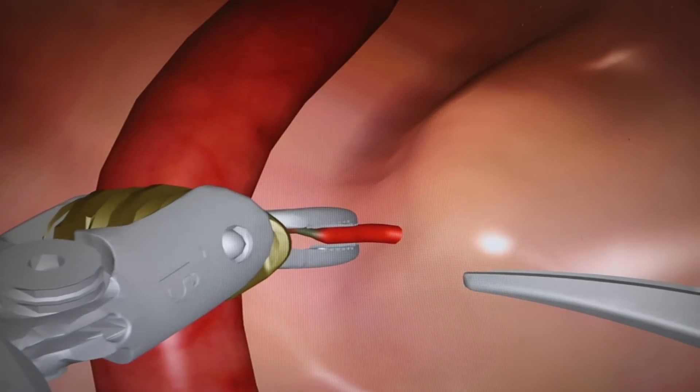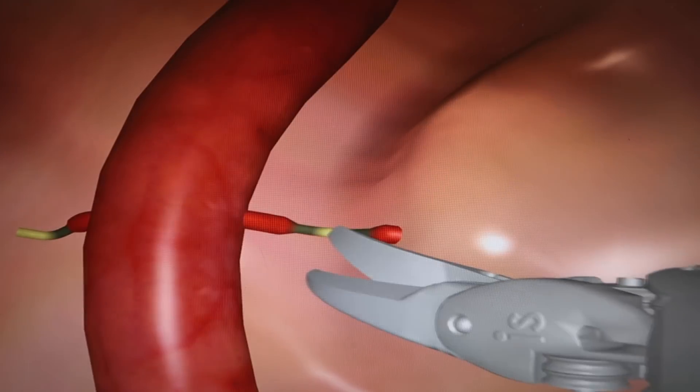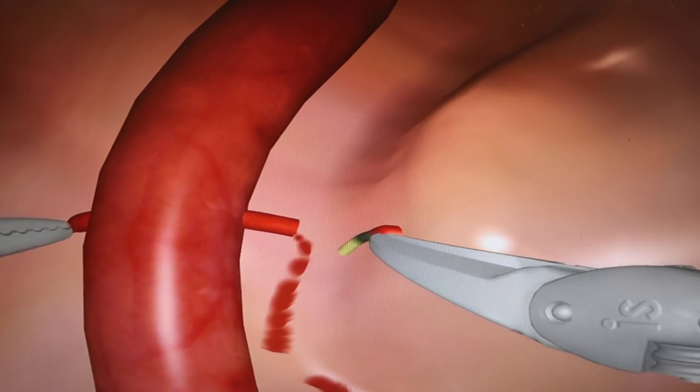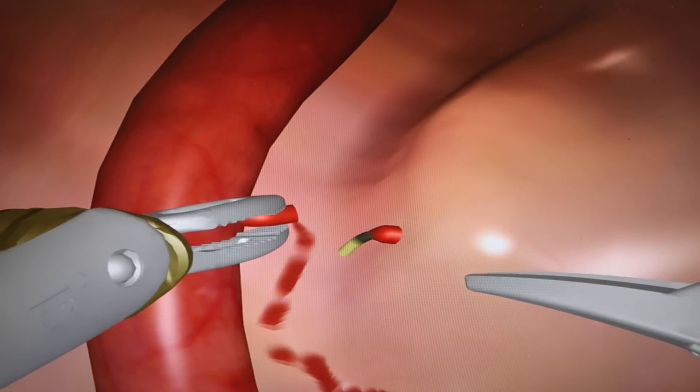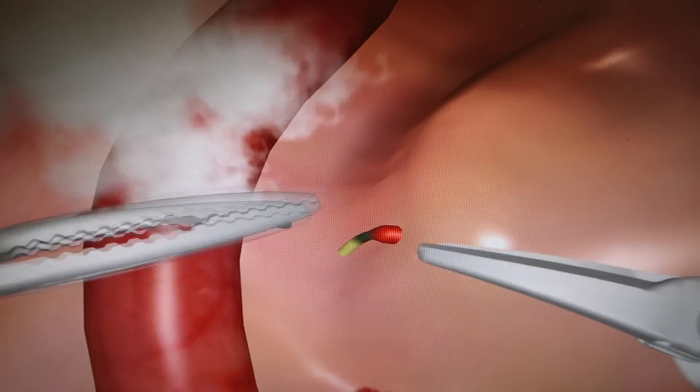But watch what I'm gonna do here. I'm gonna burn but now I'm not gonna cut totally in the middle. Oh no, it's bleeding! Oh no! And then you use the coag and it controls the bleeding.